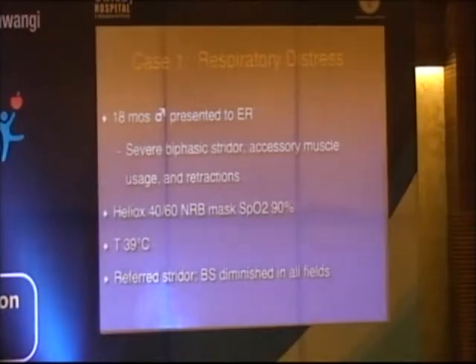What other type of patient, besides bronchopulmonary dysplasia with tracheobronchomalacia, what other type of patient would you expect to see this instead of a nice round egg? You see this abrupt decrease in flow at the onset of exhalation.